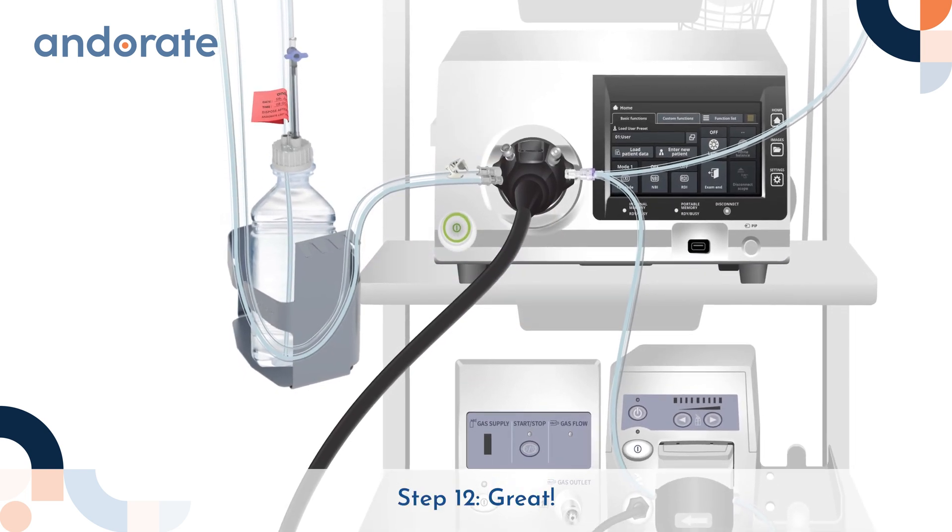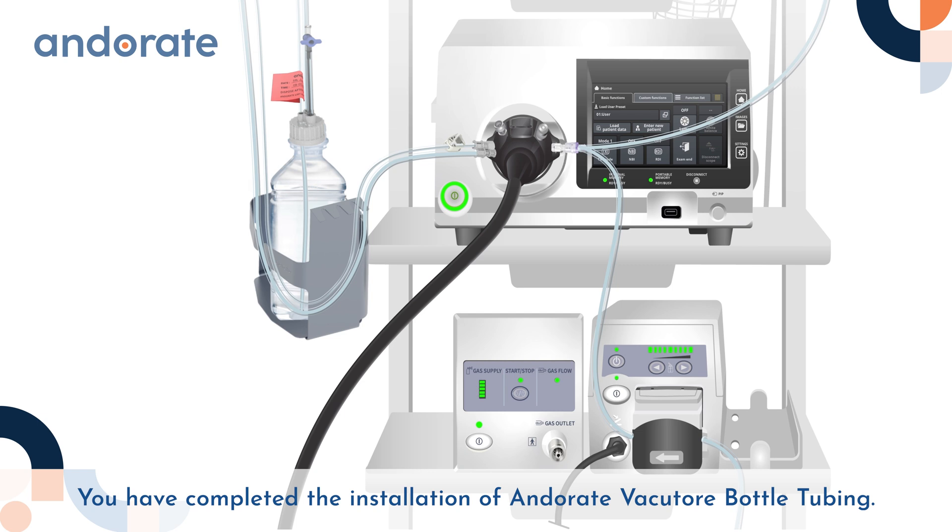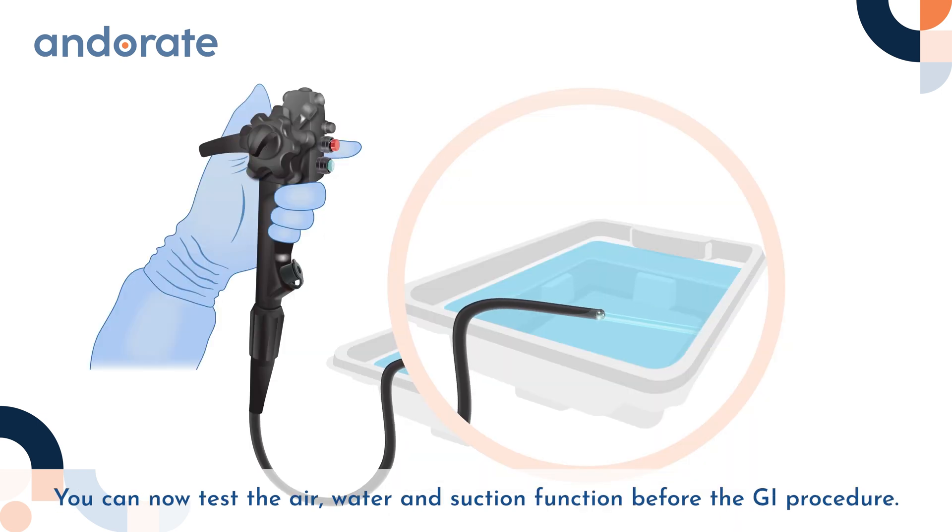Step 12: You have completed the installation of Anderate Vacuator bottle tubing. You can now test the air, water and suction function before the GI procedure.